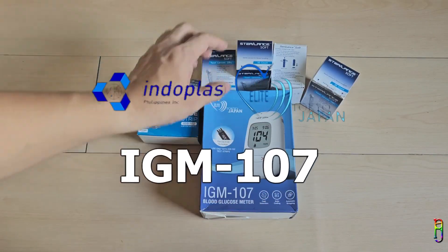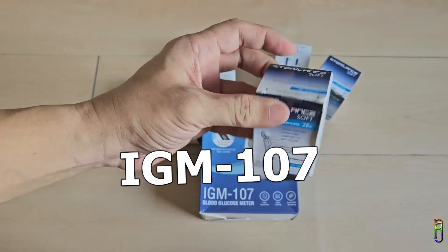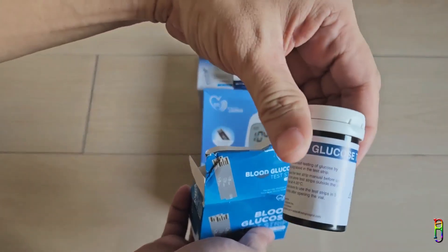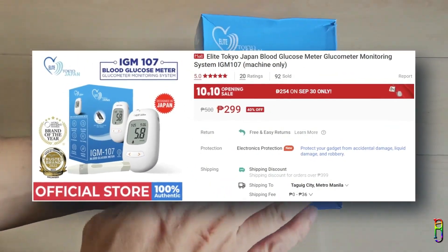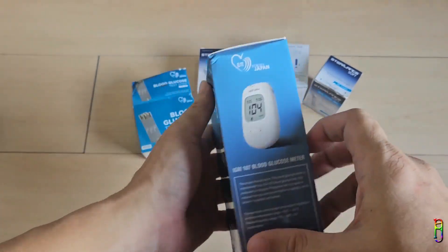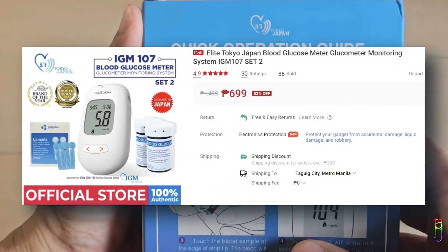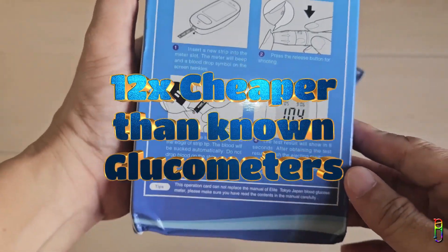We have the Endoplas Elite Tokyo Japan IGM 107 glucometer here, along with the lancets or pricking needle and test strips securely contained in a film-like container. The IGM 107 glucometer is so cheap you would think it is fake — it is only 300 Philippine pesos from Shopee. The set includes 200 pieces of lancets and 50 pieces of IGS 102 model-compatible test strips, which cost 700 pesos total — still very cheap. Known glucometers like Accu-Chek can cost more than 12 times the price.